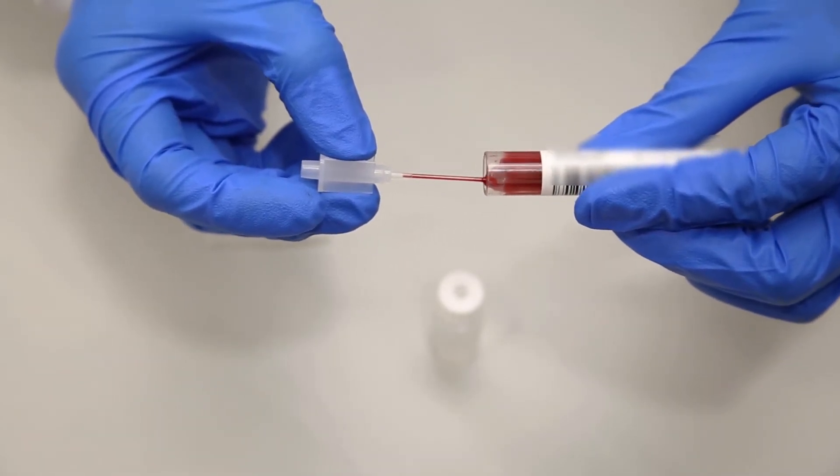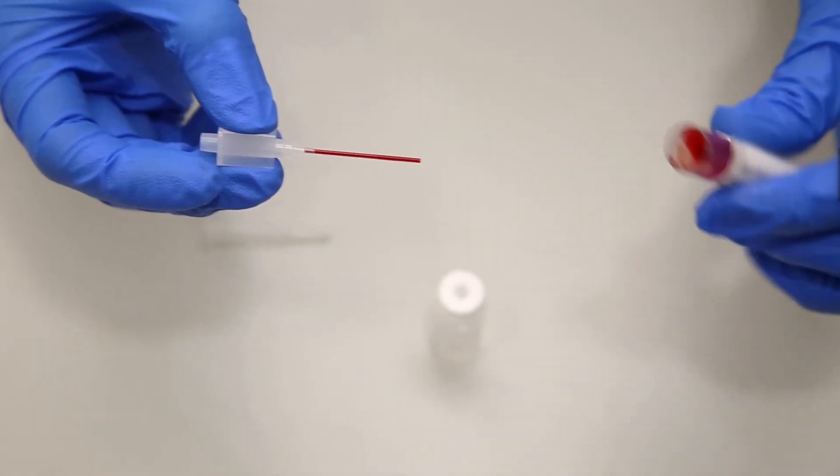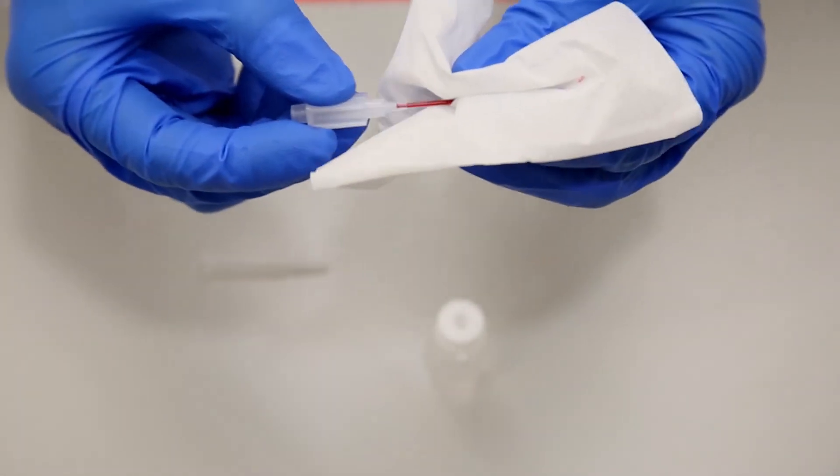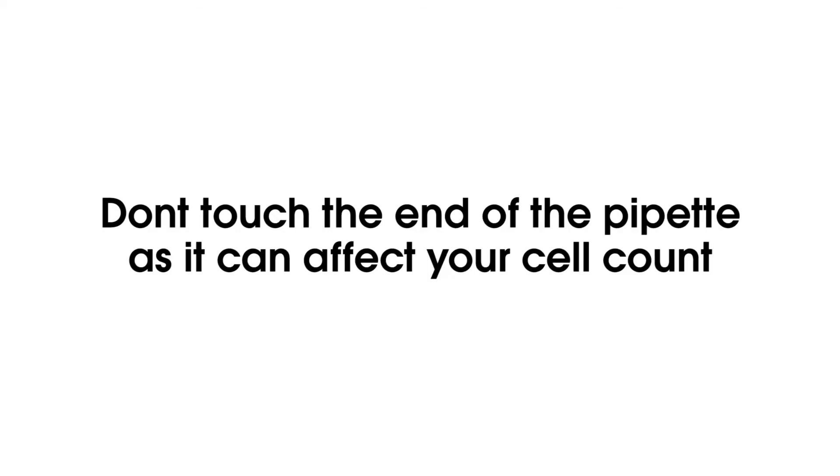When the blood reaches the neck of the pipet, no more blood will enter. Carefully wipe excess blood from the outside of the pipet using a lint-free tissue. Be careful not to touch the end of the pipet as the tissue may draw some sample from the pipet and negatively impact your dilution and cell count.